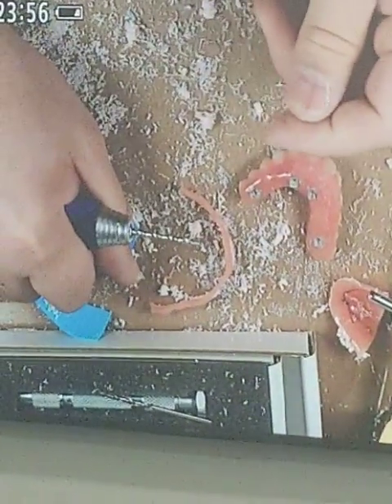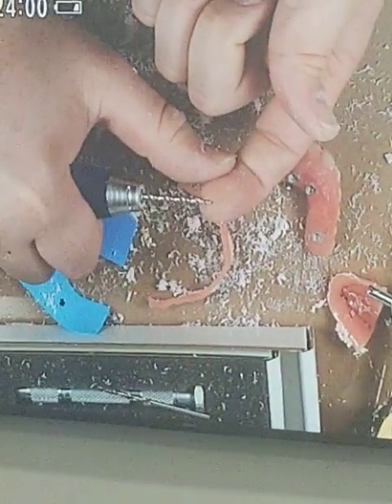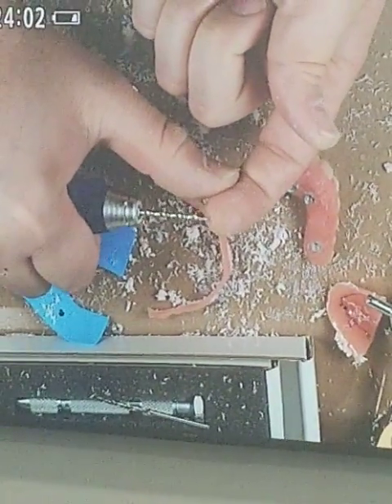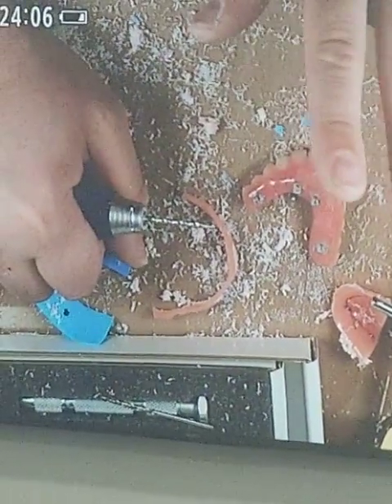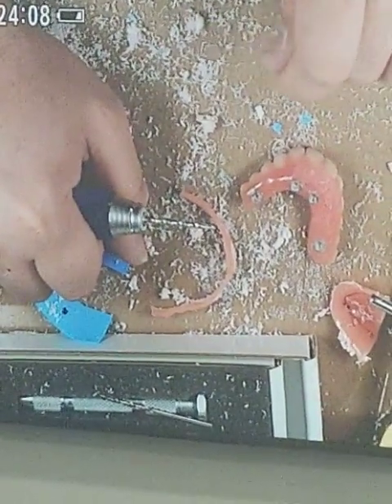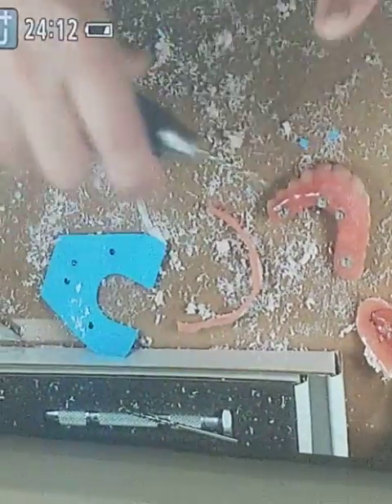Now, eventually, if you do enough of this, you'll join the club and you'll have a callus on this finger — for all the times that you've felt the tip. It won't go through, it won't hurt you, but you'll feel it. Initially it'll shock you until you're used to it, but don't worry, it's not going to hurt you.